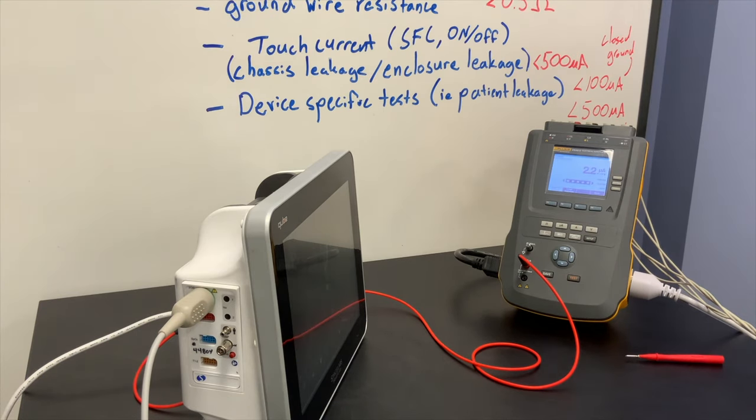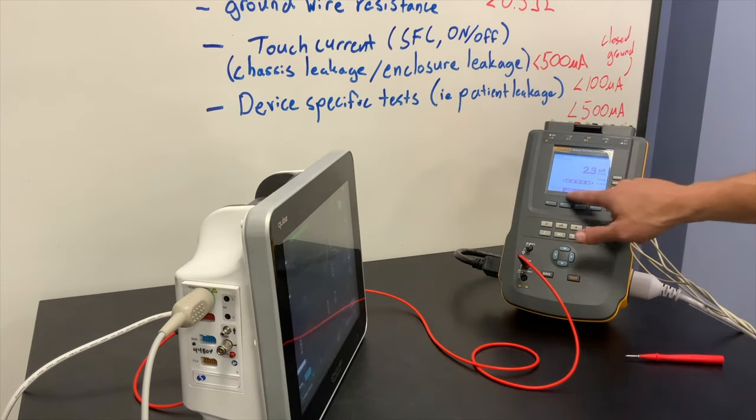You do want to run the test when the device is in the off state as well. So I turn the device off — normal polarity, neutral closed, earth open. We can run that, and both measurements check out with pretty much the same leakage currents — both under 100 and 500 microamps respectively.